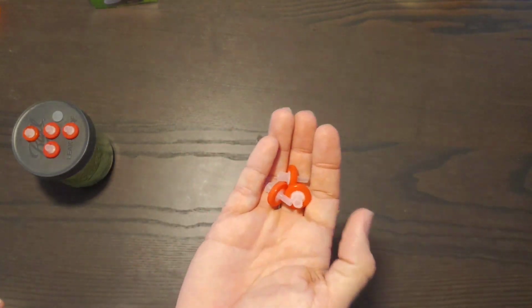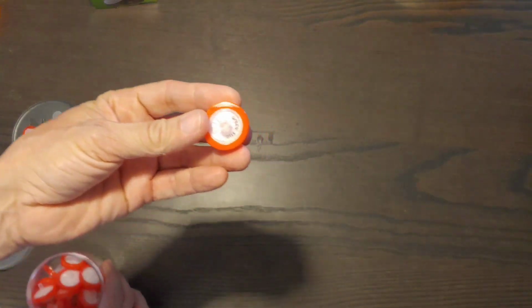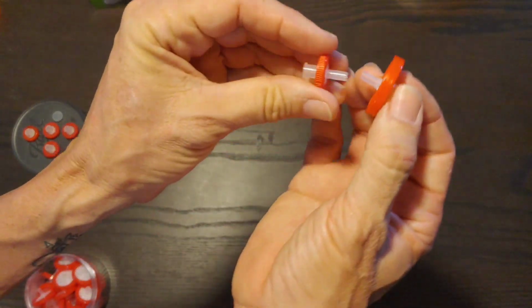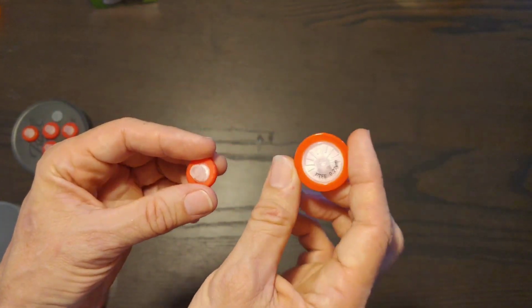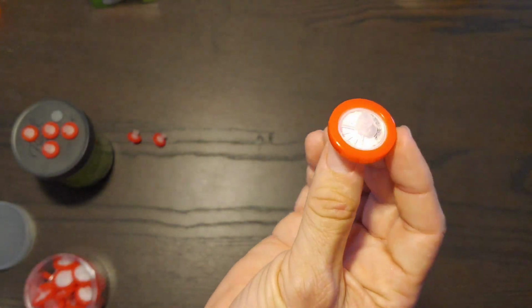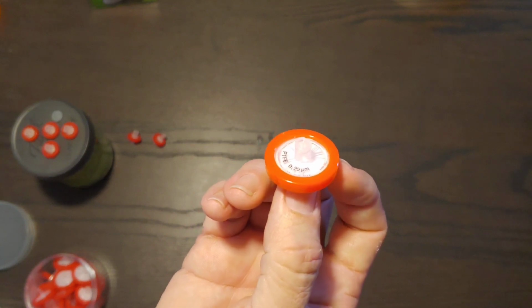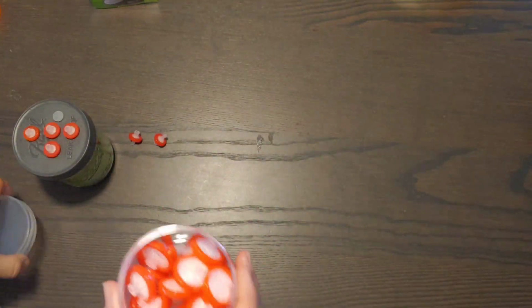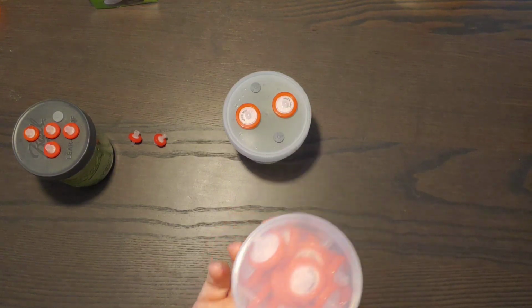Now these are smaller. When I bought them originally, I bought a big bag of them, and I didn't notice. And usually people use these bigger ones. I thought that the hole was going to be bigger, but it's not. It's exactly the same. So it's not really giving me a lot more FAE. But the filter's bigger, so it should be better because you have a bigger filtering surface. And as I said, make sure that they are hydrophobic, so that water doesn't seep in. So I bought a new batch of these, which is what I'm using in the new container. These are in my tools and materials list.